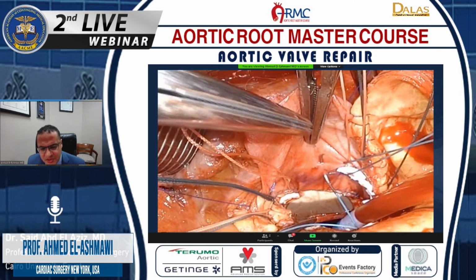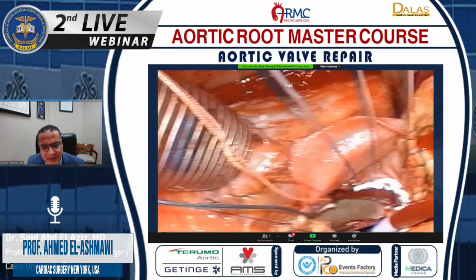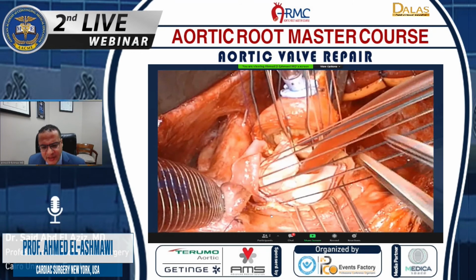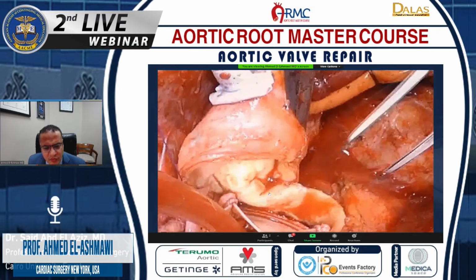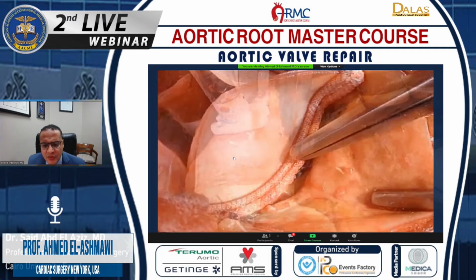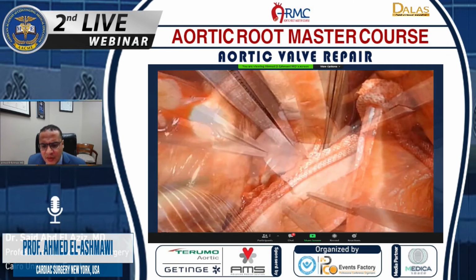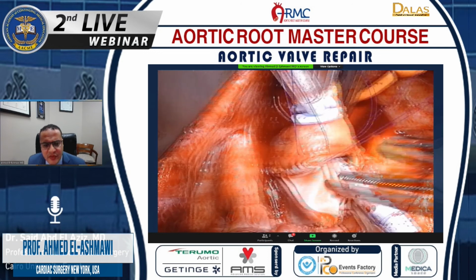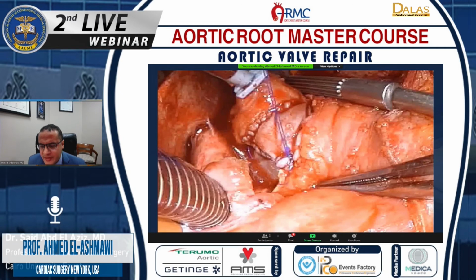Remember, at the non-coronary cusp, the suture has to go through the patch. You can put the pledget inside or outside, it doesn't matter technically. The aortic valve is lowered into position again. Sutures are cut and tied, and then we have to confirm patency of both coronary arteries after you implant the aortic valve, like any routine aortic valve replacement. Here we needed another small triangular patch just to make sure we close the rest of the aortotomy under no tension. But that part can be closed directly according to the situation.